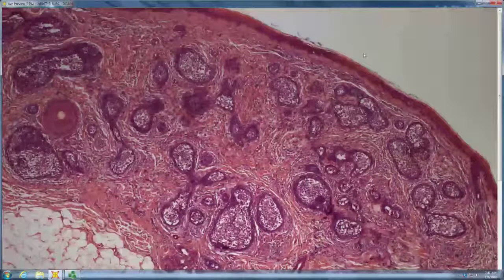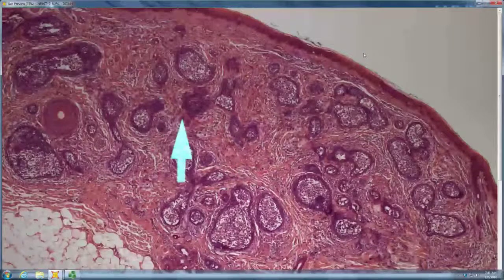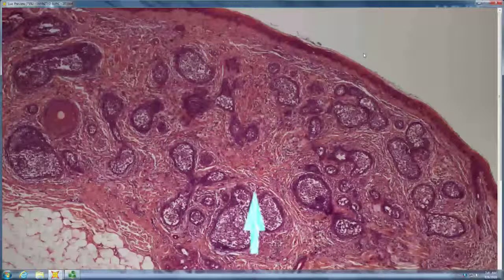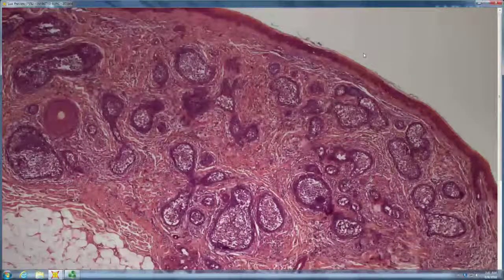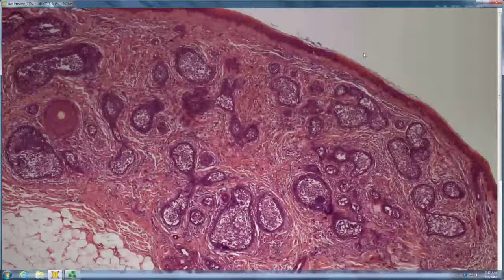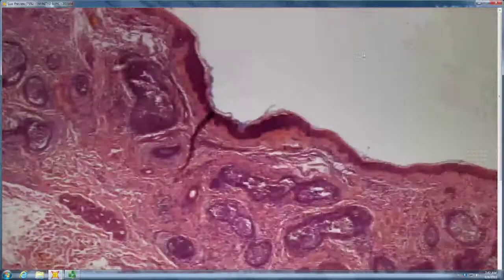So lymphadenoma, the stroma looks just like any other pilar tumor, as you pointed out. There are even papillary mesenchymal bodies in there. Everyone's favorite. The basaloid cells are just one or two layers thick, and then the center of every island is lymphocytes and histiocytes. That's a cutaneous lymphadenoma. If you want an easier name, adamantinoid trichoblastoma is also a name for it. But cutaneous lymphadenoma is what most people call it. And they're totally benign and easily recognizable.